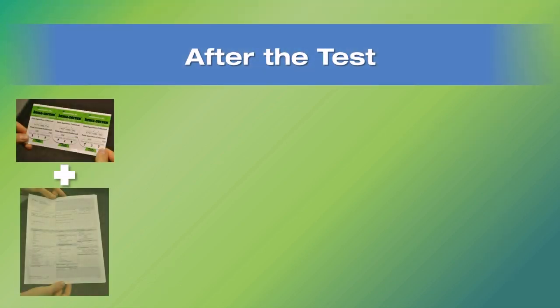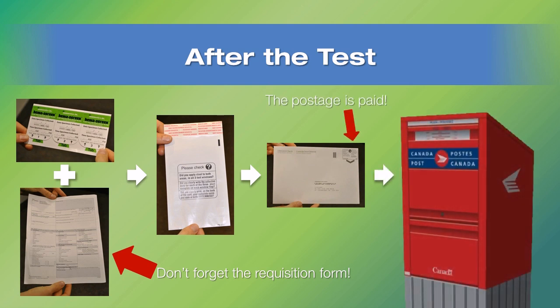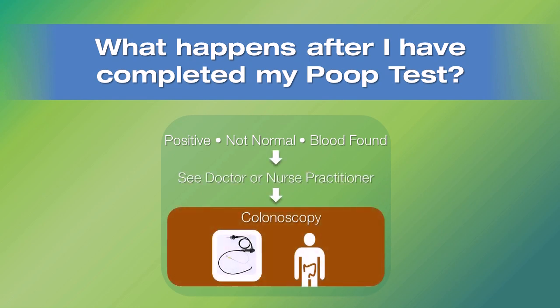After the 3rd sample is collected, place the test card inside the foil-lined envelope. Put this smaller envelope and the requisition form into the larger envelope, seal it tightly, and mail it off. The postage is paid. Your family or doctor will get the results, and you will also receive a letter from the ColonCancerCheck program. If the poop test is positive, please see your primary care provider to arrange a colonoscopy.